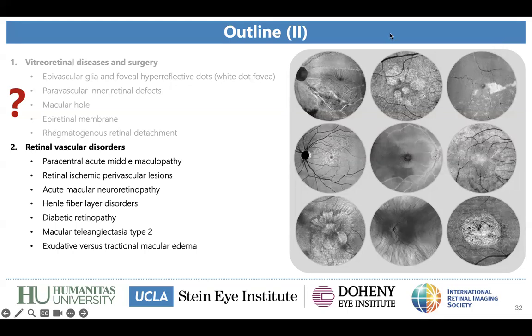So Gabriel, thinking about researching a topic that would be very useful, not for identifying the pathophysiology of the disease, but to introduce the application in real life, is to let the device do its thing and check its capability of diagnosing and helping, and really the utility of each segmentation.